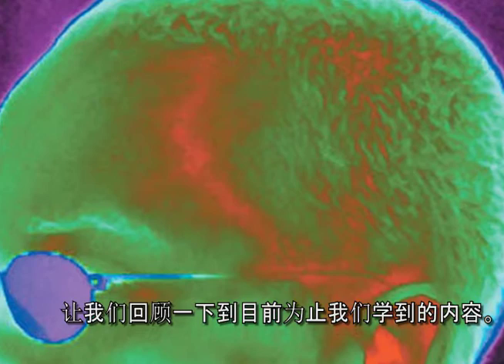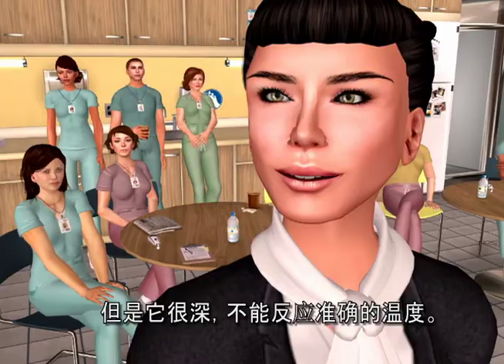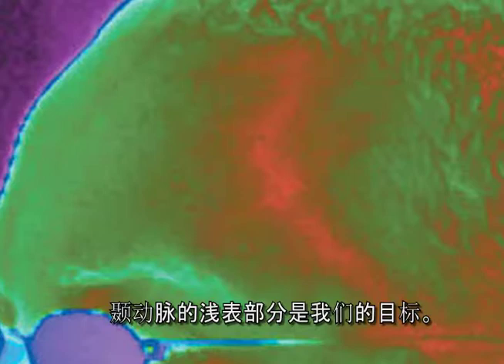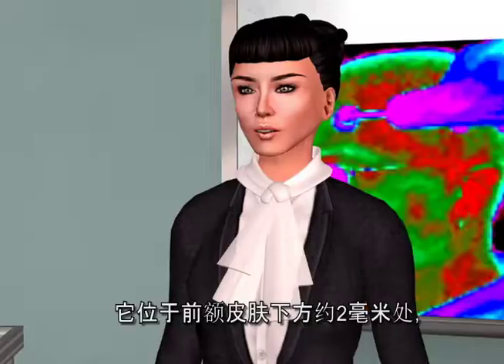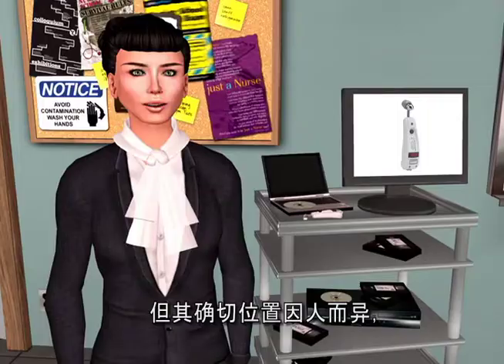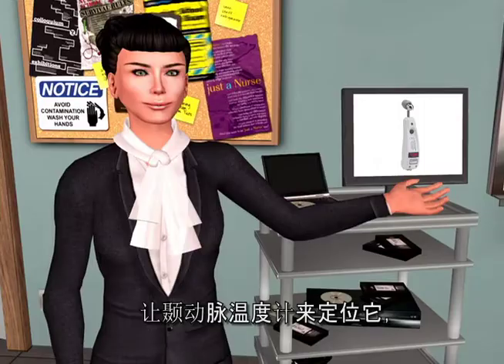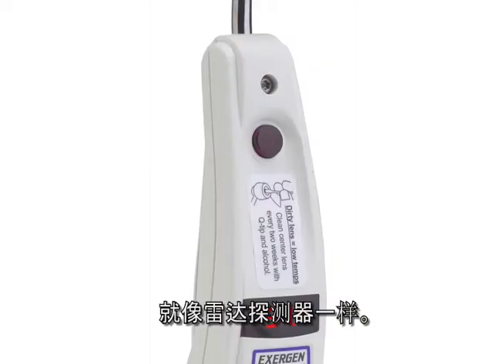The temporal artery comes up from the side of the face from the external carotids, but it can go deep and won't register an accurate temperature. The superficial part of the temporal artery is our target — located up in the forehead, about two millimeters below the skin, literally trapped between the skin and the skull. Its exact location varies with each individual, which is why we scan, allowing the temporal artery thermometer to locate it, something like a radar detector.